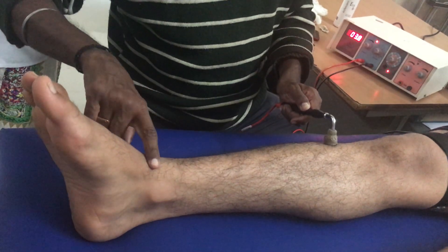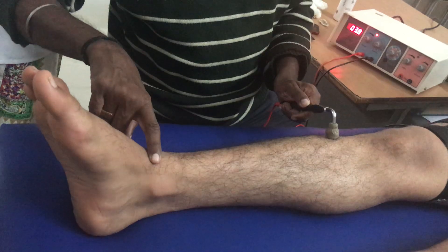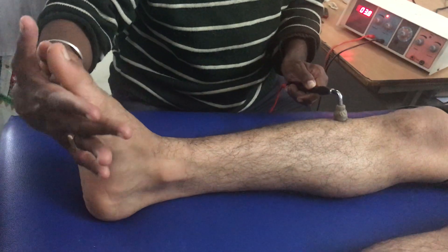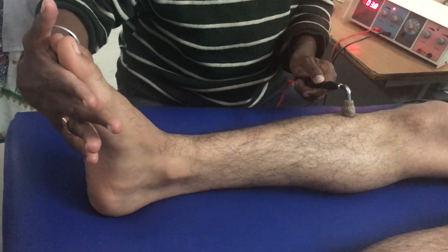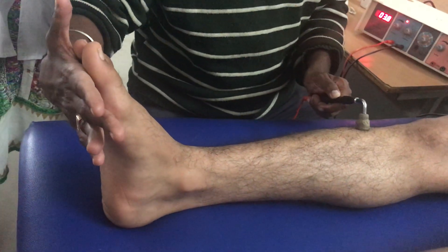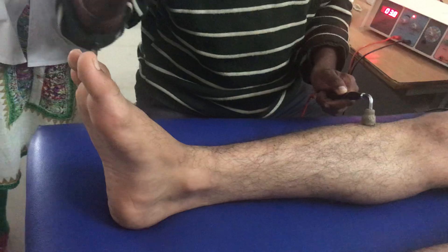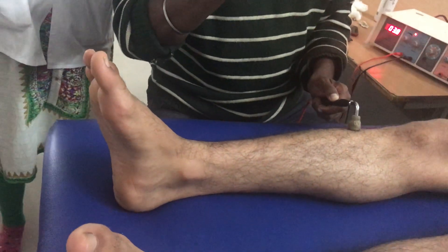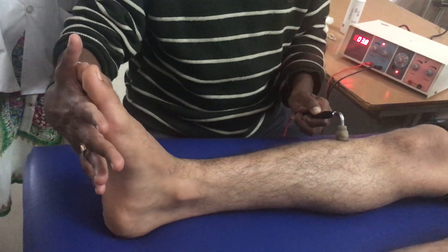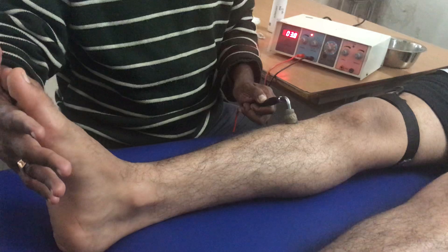I would rate this right now as a minimal palpable contraction. I will go a little bit more so that he can palpate the strength. Ideally, the foot should be supported — there should be a sandbag to keep the foot in neutral. If the muscle gets lengthened, it requires more intensity to stimulate. So I would keep a sandbag to maintain the foot in neutral, as a shortened position is always good to stimulate a muscle.